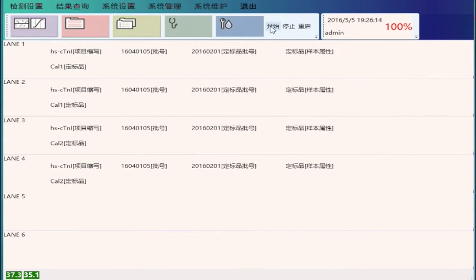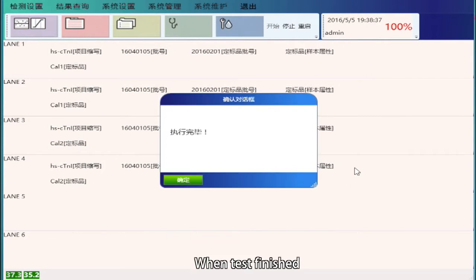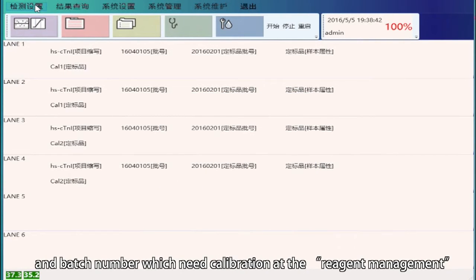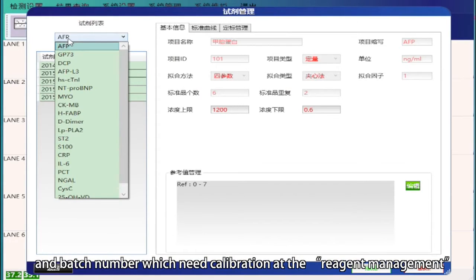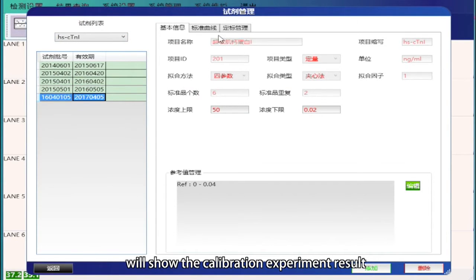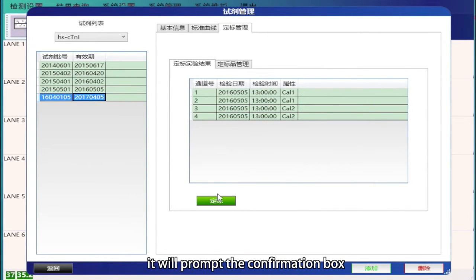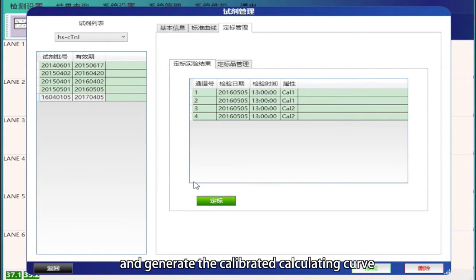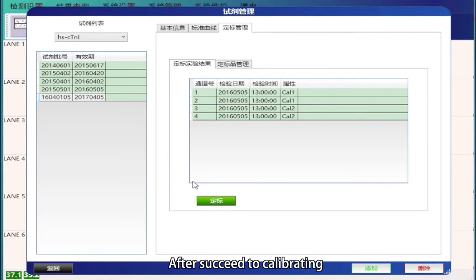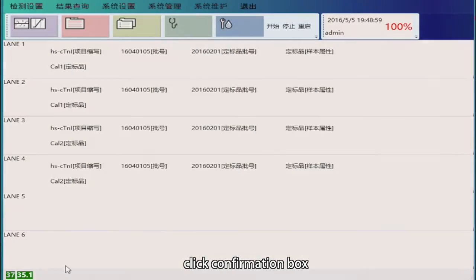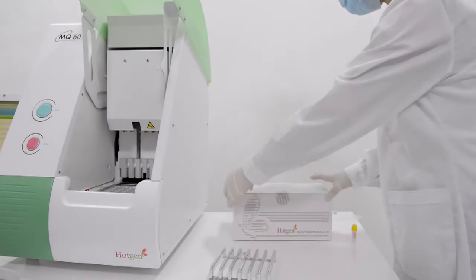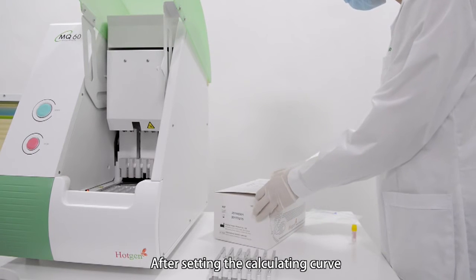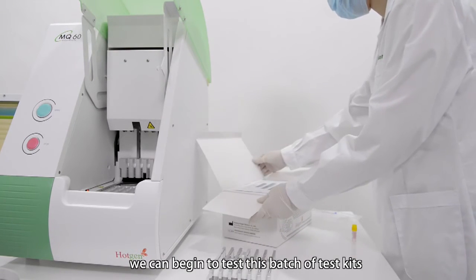Proceed with testing preparation and click Start to begin the test. When the test is finished, select the item and batch number which need calibration — the calibration management will show the calibration experiment result. Click Calibration; it will prompt a confirmation box. Click Confirm. The system will calibrate the main curve and generate the calibrated calculating curve. After calibration succeeds, click the confirmation box. After setting the calculating curve, we can begin to test this batch of test kits.